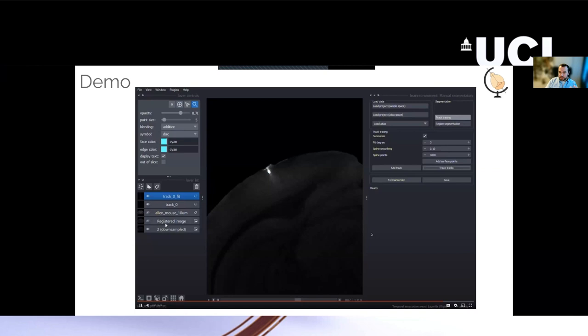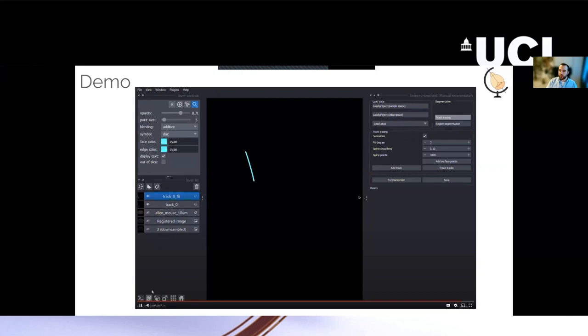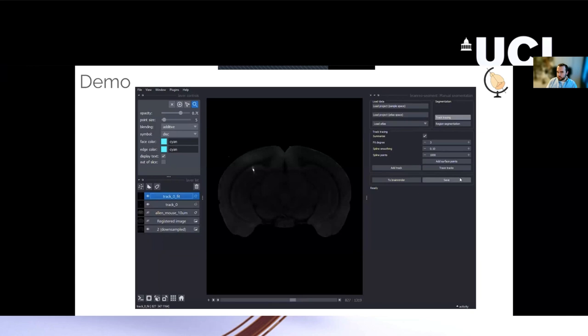And so this is quite flexible software that wasn't specifically designed for Neuropixels, but you can basically choose the number of points to correspond to the geometry of your probe. So as a simple example, if your probe was, say, one millimeter long and you reported a thousand points, you would get one marker for every micron.